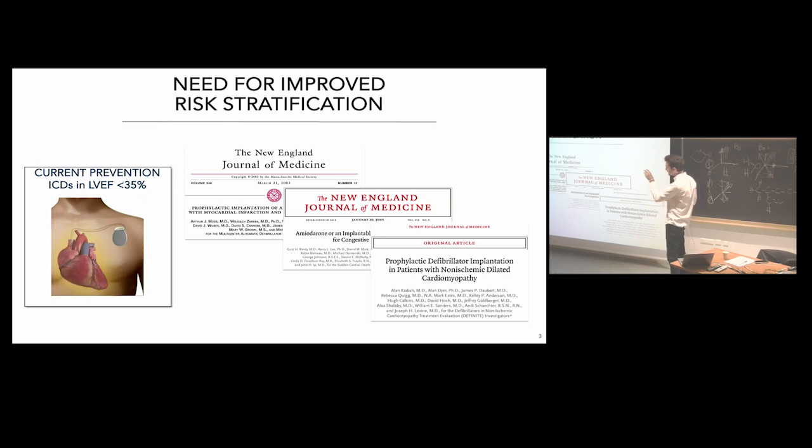Because we have a device that is very useful in case the heart stops in the 5 years. This is called the defibrillator. This is what you see here. And the cardiologist needs to know if in this patient who had myocardial infarction, we will implant this device to save his life in case his heart stops in the 5 years.